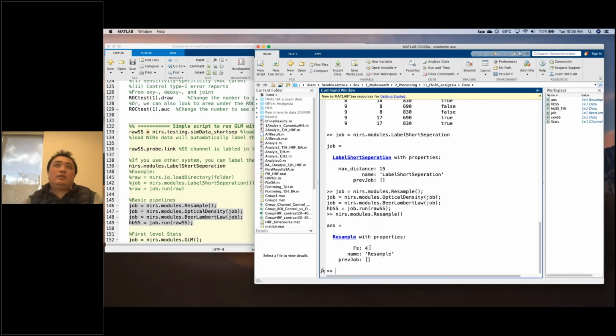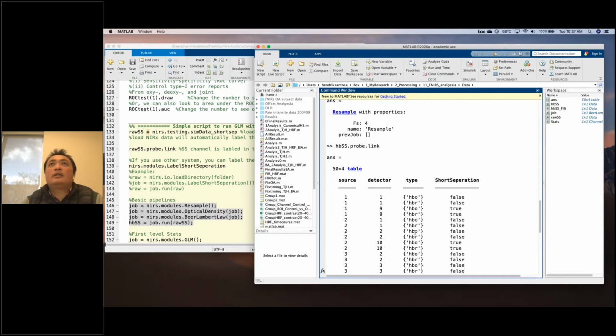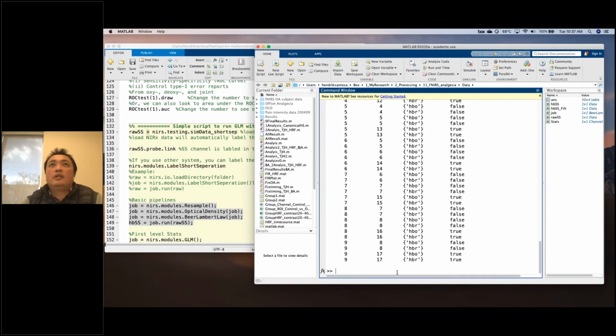Then get the optical density, then use the Beer-Lambert law, and then get the hemoglobin data. So you can see this is the hemoglobin data with short separations. You can see this still has this one, and you can also see the probe configuration.